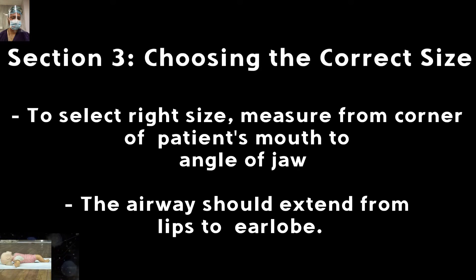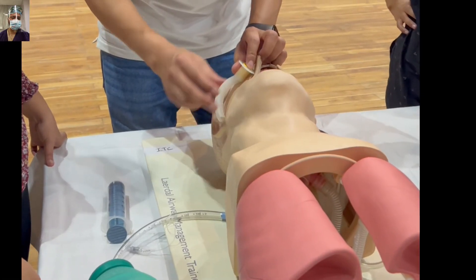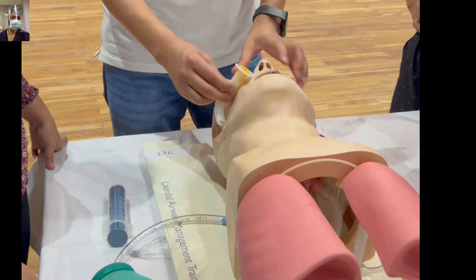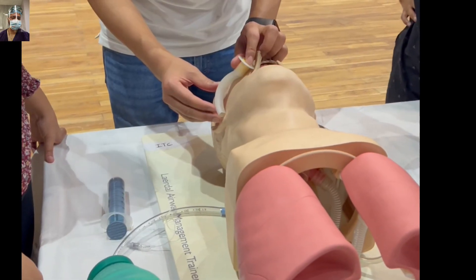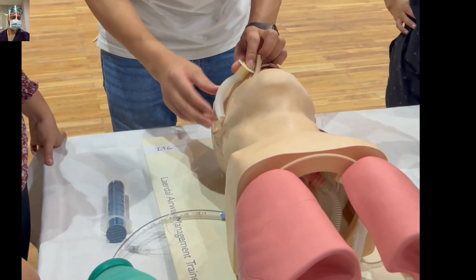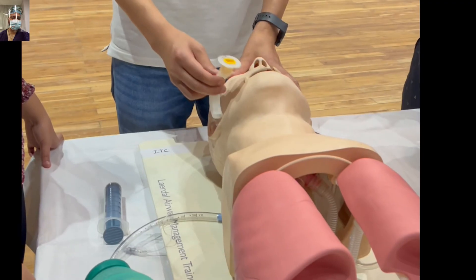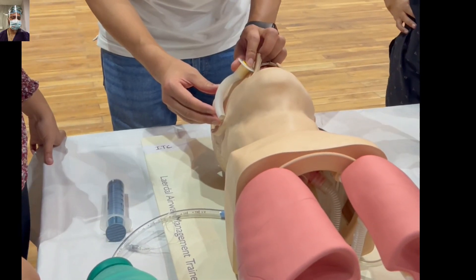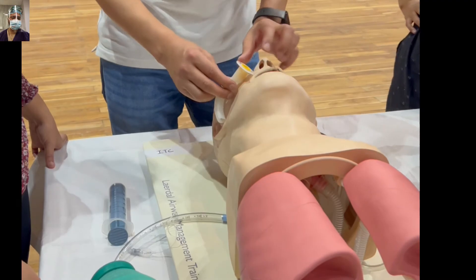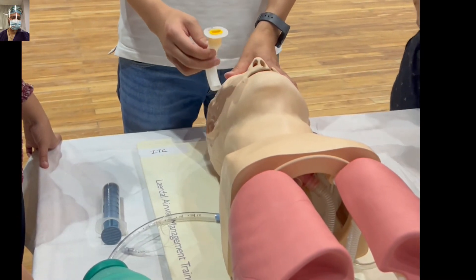The next step is to choose the correct size of the Guedel's Airway. The method is simple: you measure the distance by placing the Guedel's Airway at the angle of the mouth — the angle of the jaw — and the tip should reach the ear lobule, as being demonstrated. So the correct size is when it extends from the angle of the mouth to the tip of the ear lobule.